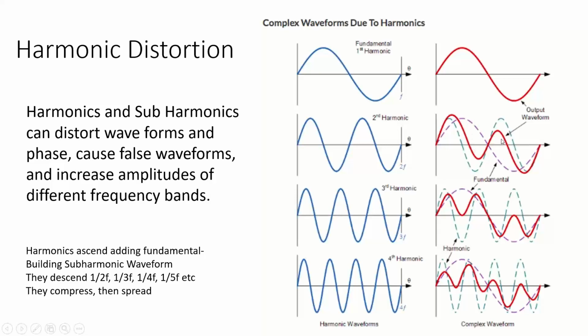You can see that you get all these different waves beating together. What happens is they produce different phases. They're out of phase, and hopefully you remember that from my other lectures. Those phase cancellations shift and alter the shape of the wave, so it goes from a sine wave to maybe something more like a square or a sawtooth wave. So let's look at that. Now, when these other waves come in, they also create subharmonics.